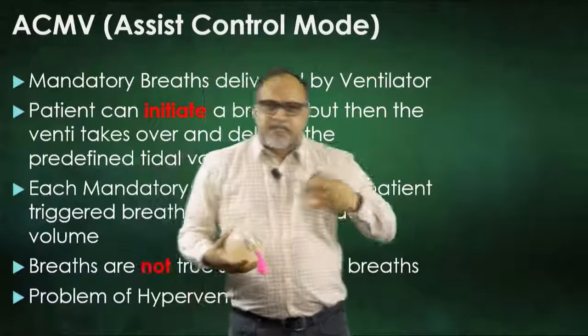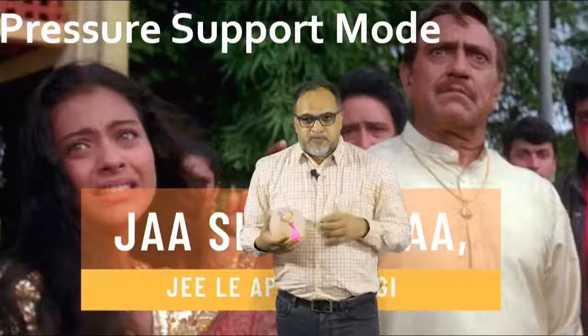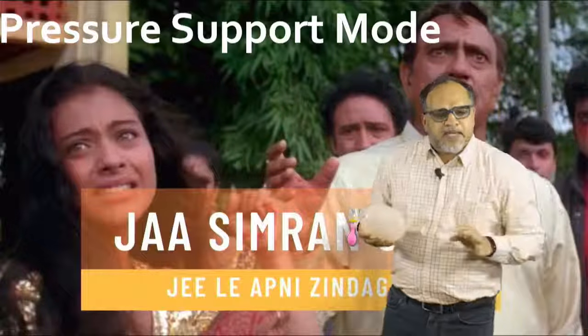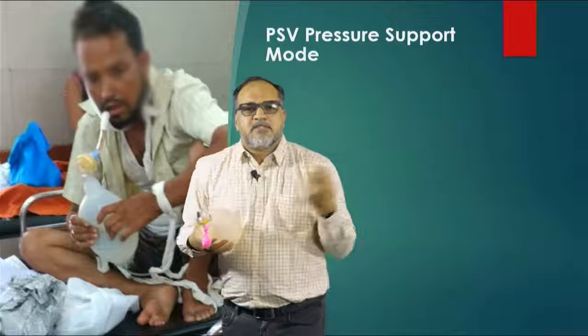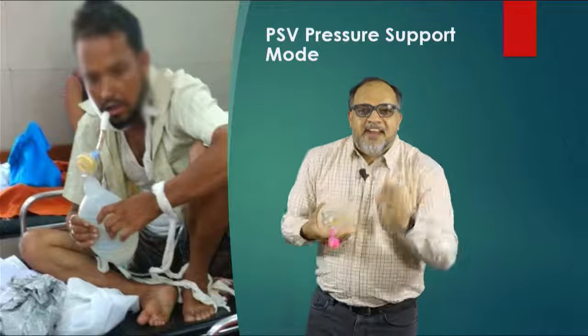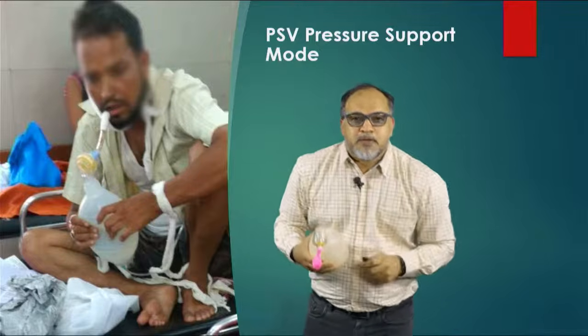Now, the next mode that was decided was pressure support mode. And in pressure support mode, it was left to the patient. The patient has to breathe on his own. His breaths are literally in his own hands. He has to trigger his own breath and the ventilator will just support.